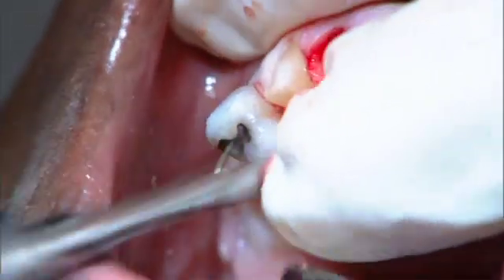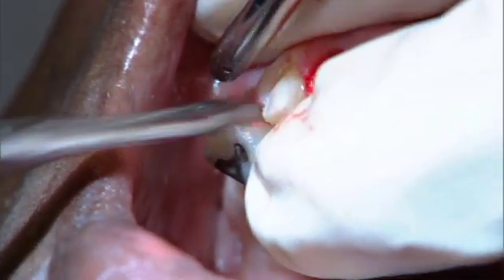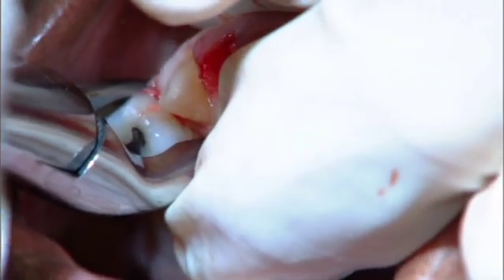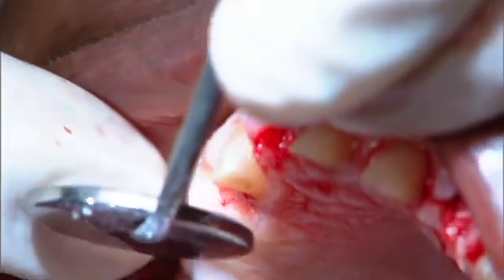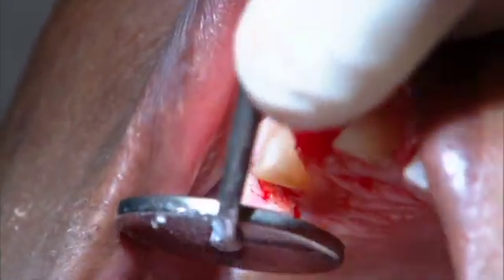There again, I'm trying to preserve as much hard and soft tissue as I can. Is this an open beak or a closed beak? Open. Okay. You okay? Mm-hmm. I'm just taking it really slowly. Thank you. Great. Very good. And root tip over there. All right, we're good, CB. We're good.